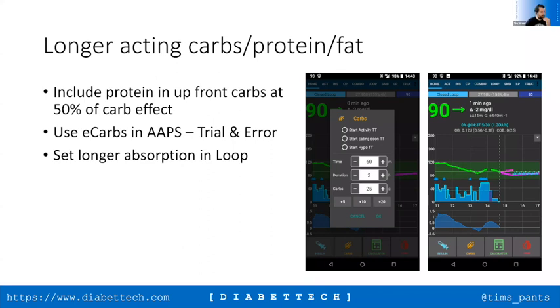Yeah. I mean, one of the things, if you look at what each of these things is doing, I don't use the 15-minute trend because I don't use the bolus calculator, let's be honest. I just basically dose some. I've been using the OREF1 algorithm since it appeared in 2017. And for me, the great thing about it has always been that you can just bolus some and then leave it to deal with stuff in the background, or enter carbs and leave it to deal with stuff in the background. And I found that to be tremendously helpful.